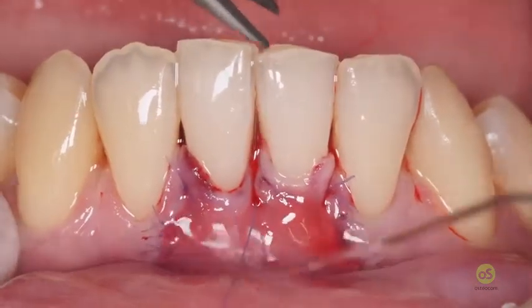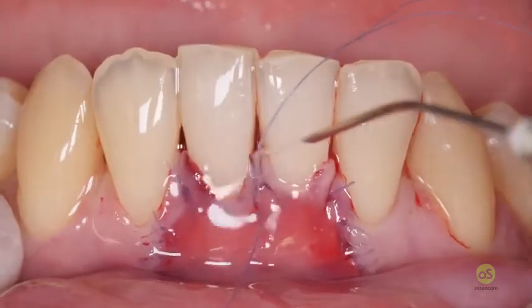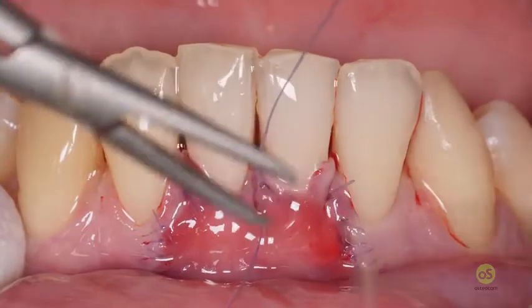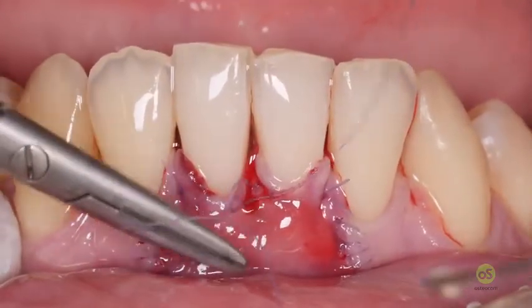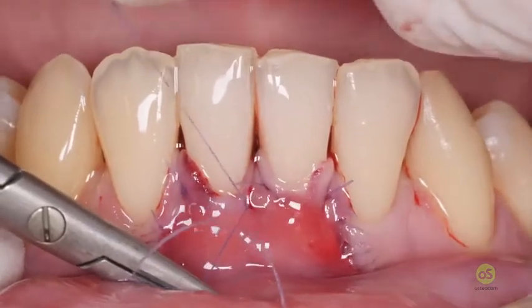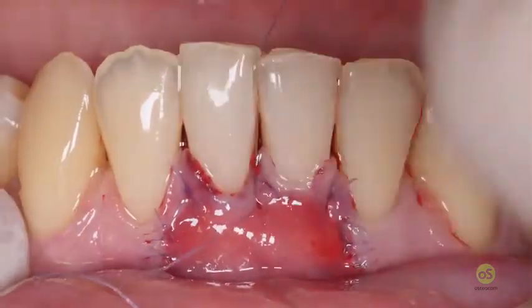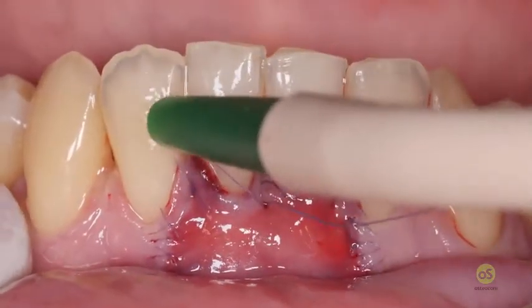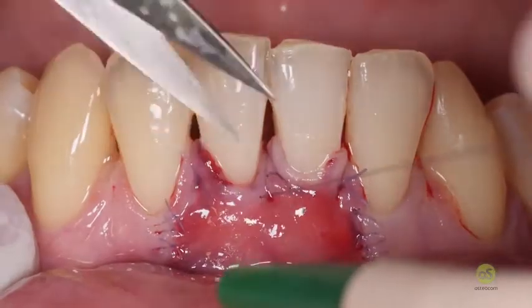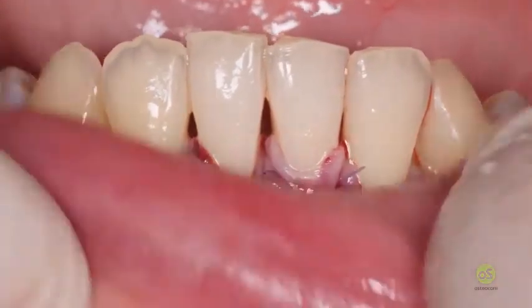I have to see exactly that the compression is above, and on the horizontal surface. Okay, that's the end of the story.